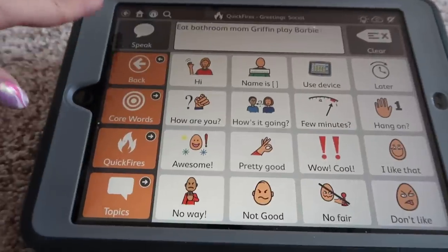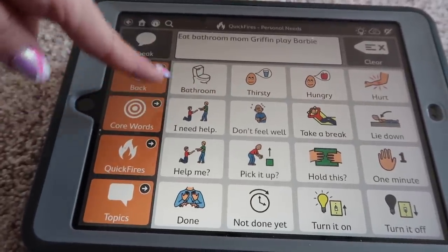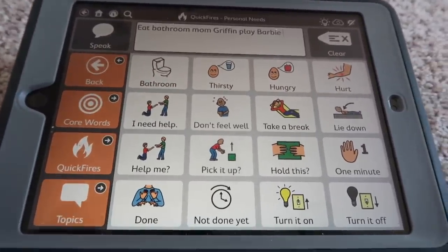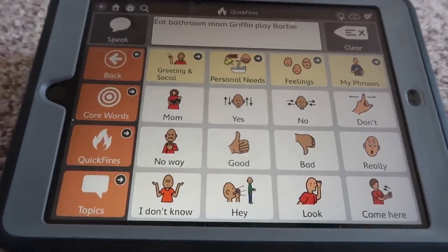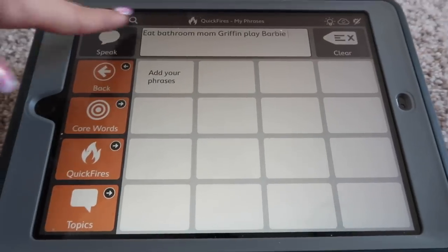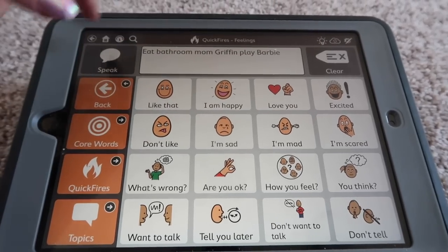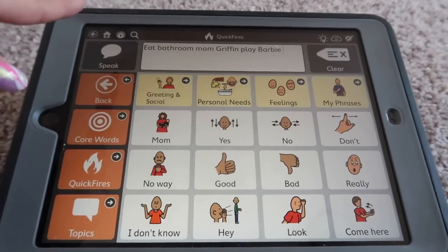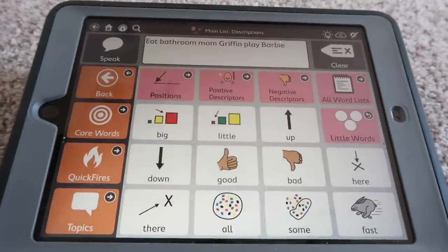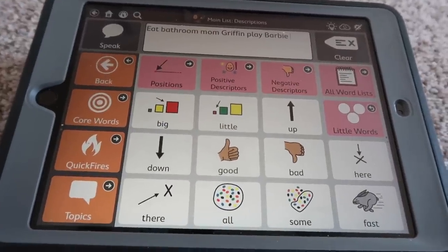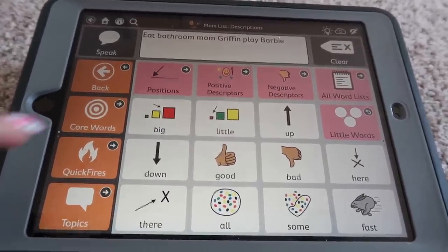There are feelings, personal needs, bathroom, 'need help' — it just goes on and on. This application is truly amazing because there's so much. There are feelings like 'I love you,' 'I'm happy.' So there's a bunch of things in this app for everything she could possibly need — for therapy, for school when she starts school next year.